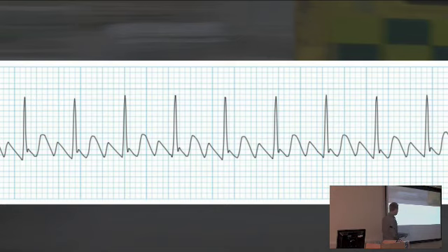And what's happening is you've got this flutter wave circling around the atria at about 300 beats per minute. And every now and then it'll conduct. But it tends to be fairly predictable about when it's going to conduct. It depends on your conducting system, how healthy it is, and how much adrenaline is in your system. It will never go up 1-1, because your ventricles can't quite keep up with a 300 beat per minute rhythm. But it could go up 2-1, so you could get a 150 beat per minute narrow complex tachycardia with atrial flutter. Or it could go at, let's say, 75, 4-1. Or it could go at 3-1, about 100. And that's what you've got here.